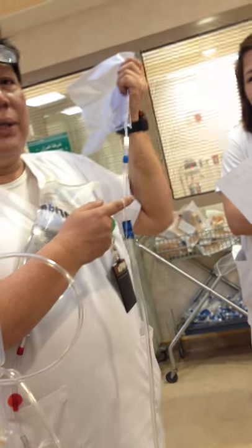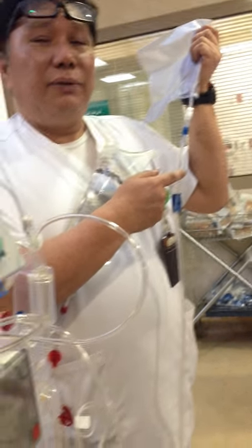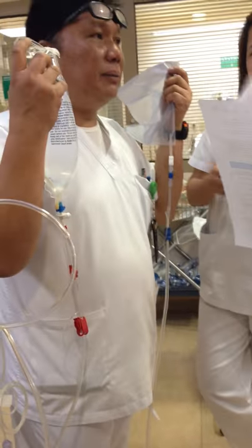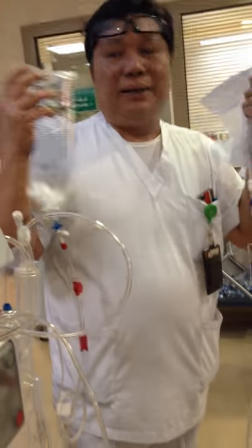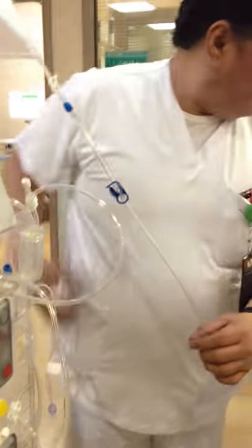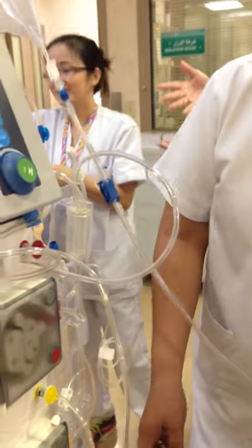Is there a specific range for the calcium of the patient before we can proceed? What's the normal range for calcium? 2.2. That's why I put this one in here. We are on the range. If it's low, you cannot. That's why they are doing the blood gas and everything.